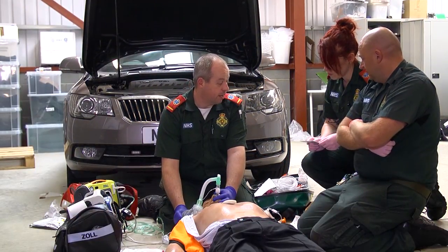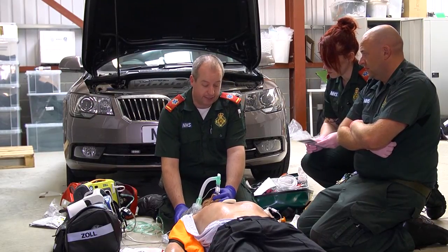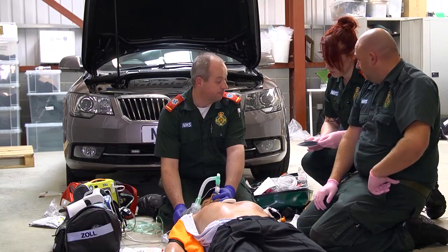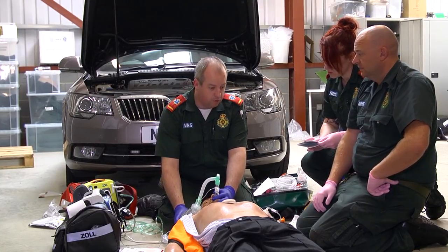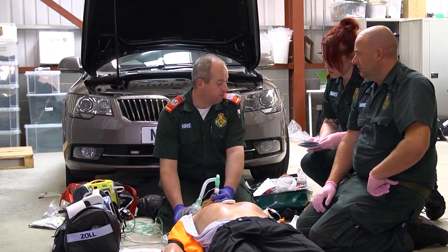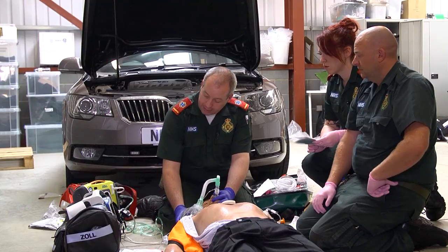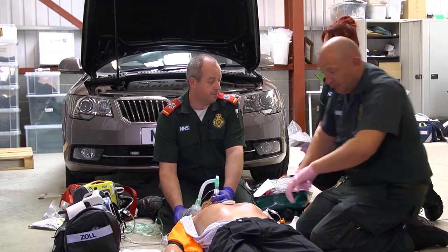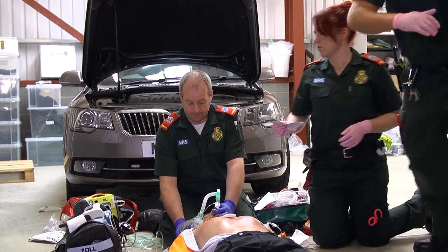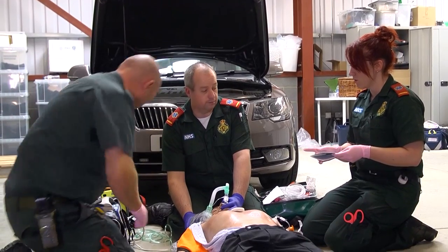Yeah, breathing. So there's no respiratory effort at all from this patient, so we'll just continue to ventilate once every 6 seconds. Yeah. Do you want to connect to a ventilator? Or are you happy at the moment? I'm happy bagging at the moment. I think we'll consider that when we move on to the vehicle. Okay, and the CO2? So CO2 at the moment is 4. And did you want to get the SpO2 on? Yes, so I'll go and start doing that for you, absolutely, yeah. Okay, so we'll get that on, see what the O2 is.